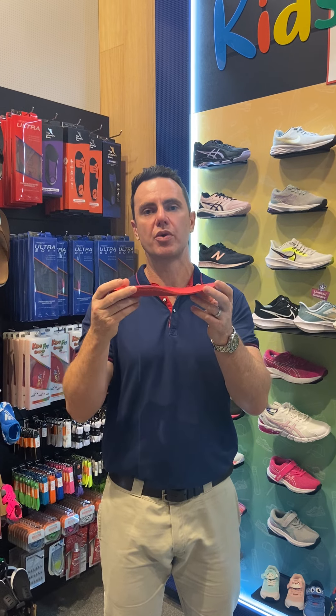Hey guys, it's Kent here from Ergonix and we're down here at the Athlete's Foot in Carindale and we're looking at the Ergonix KidsFit Sports Orthotic Inner Sole.